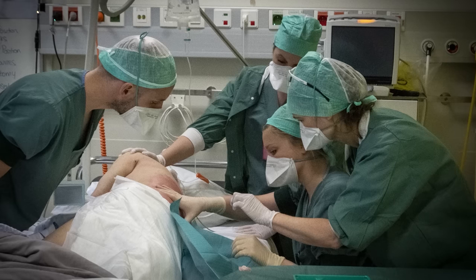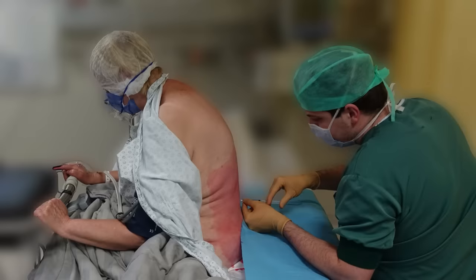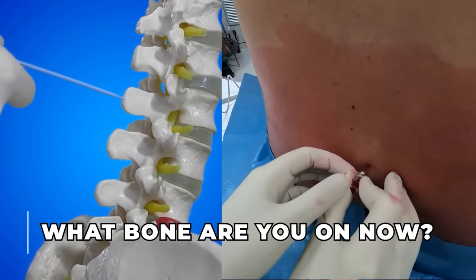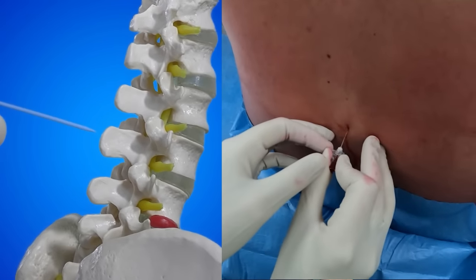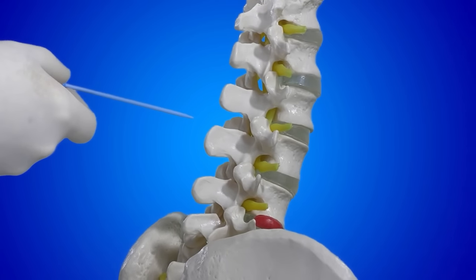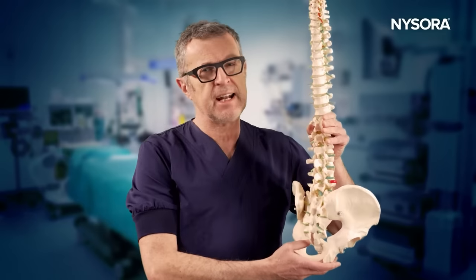As a chief of service, I'm often the one who gets to solve the difficult spinal. When I step in to help, I usually do not scrub and take over. Instead, I ask the trainee or colleague: what osseous structure — what bone — is stopping your needle now? The answer to this question is the key to meaningful redirection and success, and yet I'm always surprised that no one thinks about this when the needle path is stopped by bone. I then grab the spine model and explain the principle of three axes, which often solves the problem immediately.